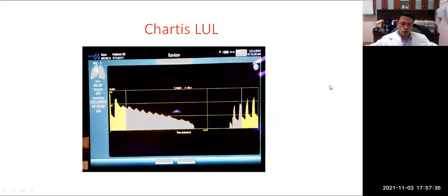That's not the rule. The rule is that you should wait for 8 minutes. The average, I would say, is 8 minutes. You should stay there with the balloon for 8 minutes maximum until you either give up or you move forward. The typical one that I've seen is maybe 2 minutes, 3 minutes.